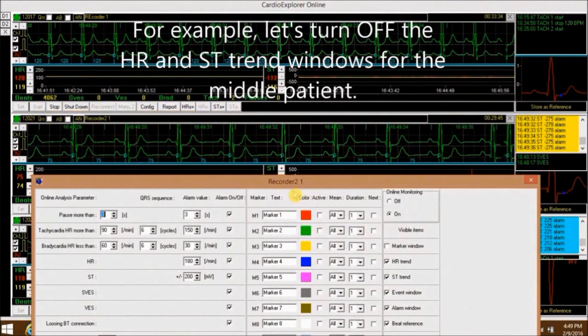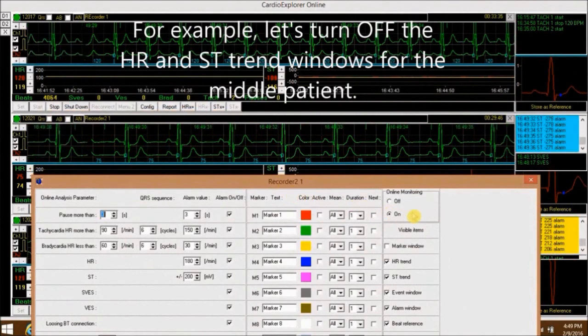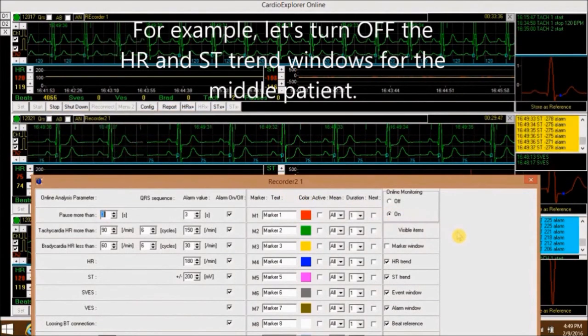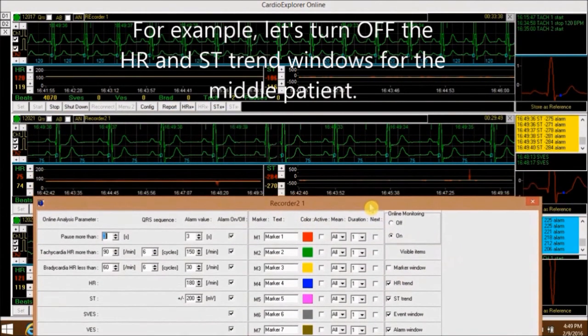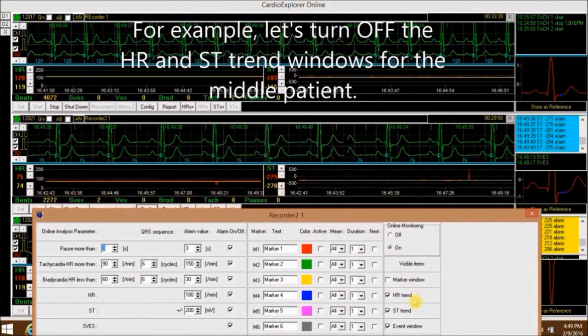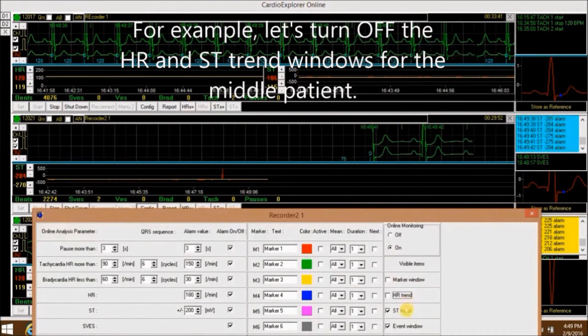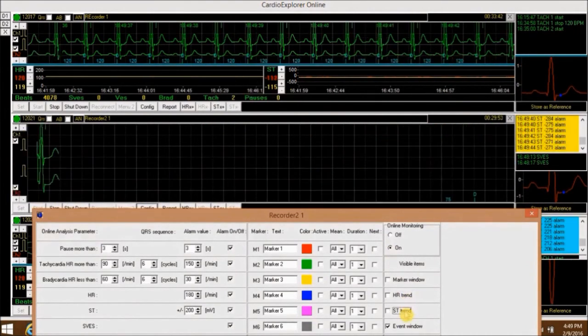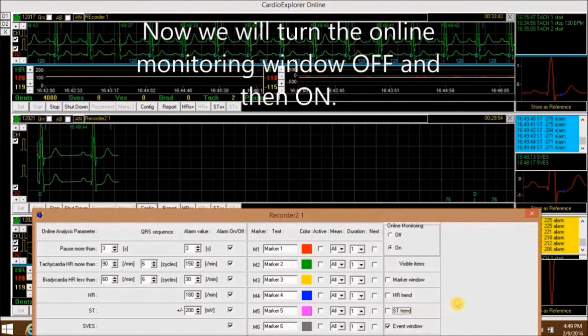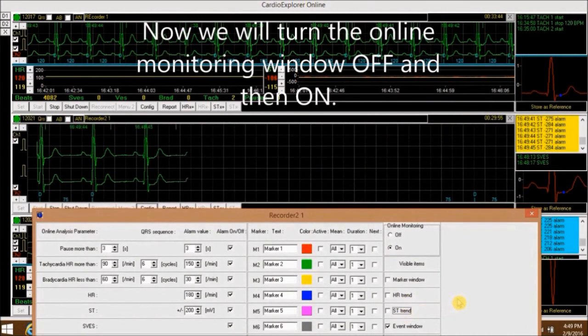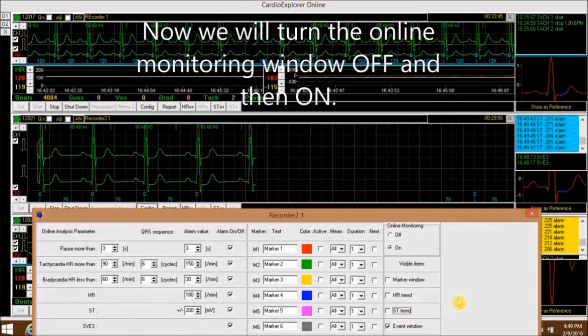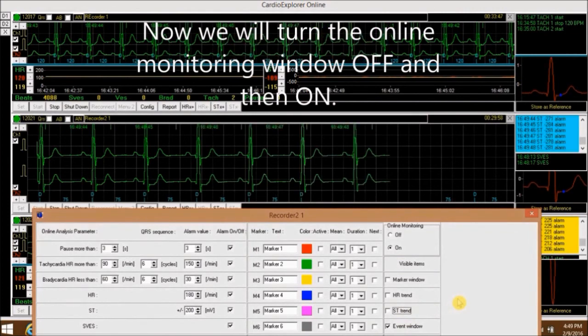For example, let's turn off the HR and ST trend windows for the middle patient. Now we will turn the online monitoring windows off and then on.